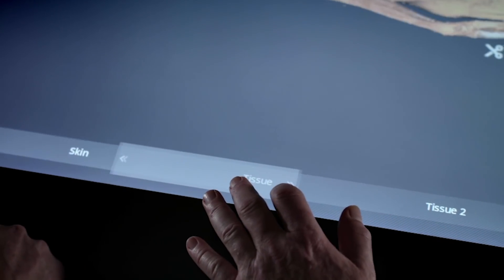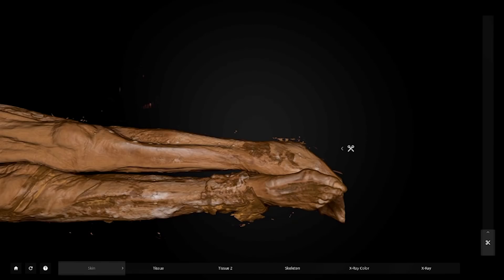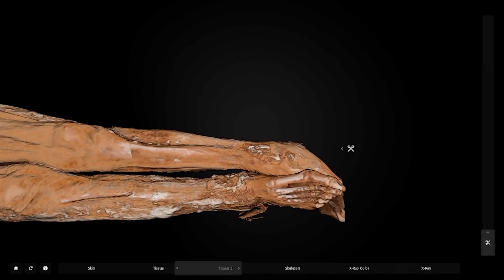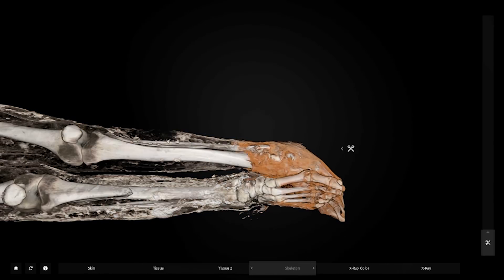With just a swipe of a screen, it can move between multiple layers of the body, digitally stripping back skin, revealing internal organs, and showing the skeleton beneath.